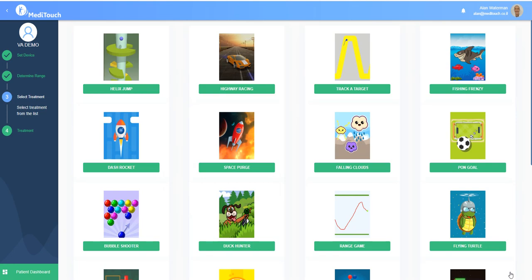Okay, now we know that task type was we're moving from the left to the right, so we have to think about which task types the object is going to be moving from the right to the left. Now I've actually generated a separate video which actually looks at categorizing task types. Okay, so we can categorize them in terms of whether they're looking at the objects on the screen in the game going in a horizontal direction, or whether the objects in the screen are going in a vertical direction, whether it's going to be a continuous movement, or whether we're going to have to get to a target and hold for a specific amount of time.